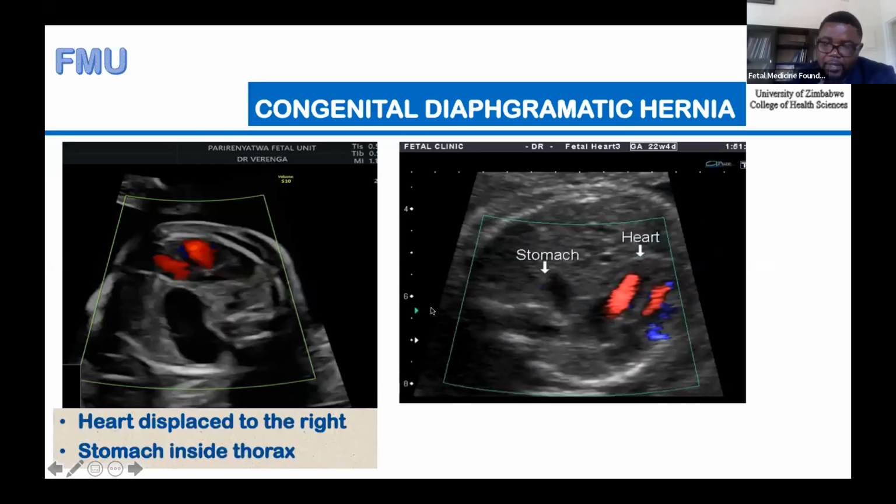Other cases, which are often missed when patients come to us, to be honest, are the patients who had diaphragmatic hernias. We diagnosed close to 10 of them, and maybe only one had been identified as having such. The reason comes from exactly the same videos I showed you from the beginning: you should make a sweep and check the relationship of the heart and everything, because congenital diaphragmatic hernias invariably shift the heart position or the stomach is shifted. So look at this one.